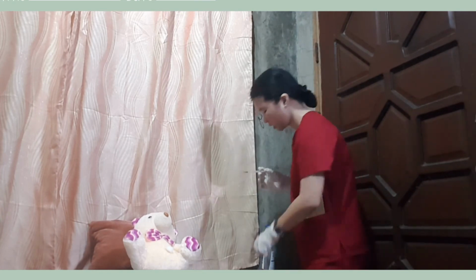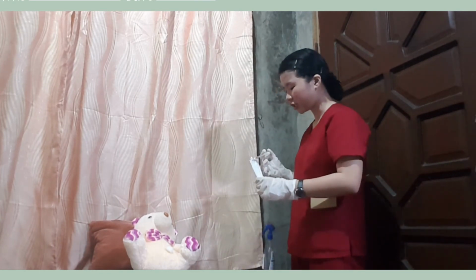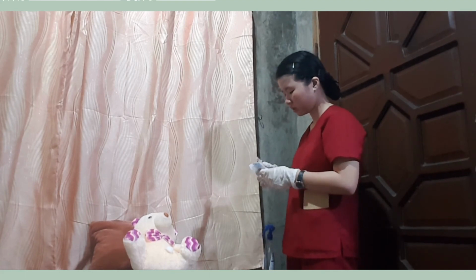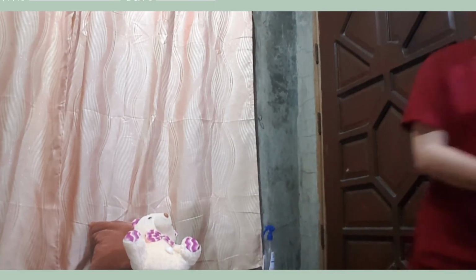And now we're going to do an aftercare, which is to discard the needles that we use in a puncture-proof container. This ensures the patient's comfort and to discard the needles properly, to prevent contamination. Now we're going to put it in a puncture-proof container and dispose. And now we're going to remove our gloves.